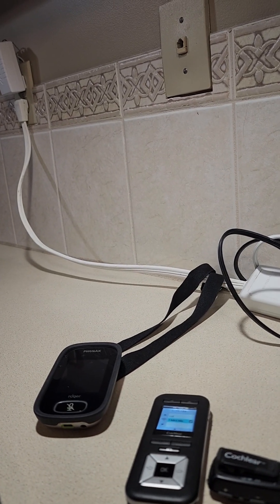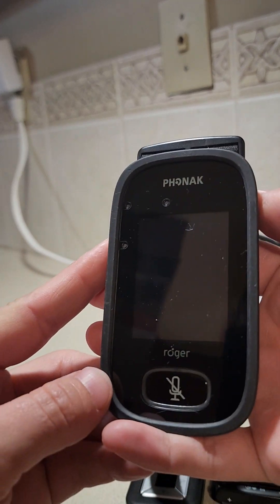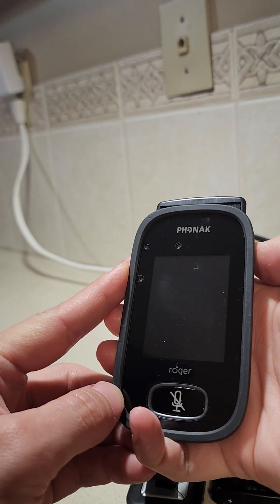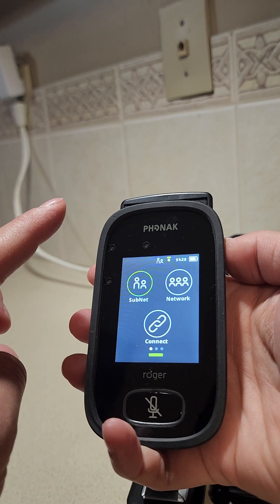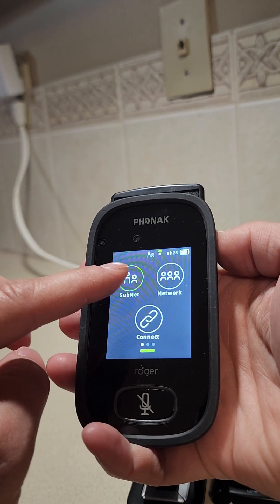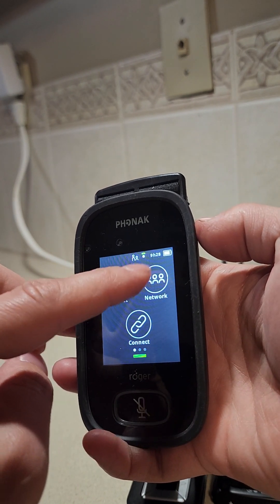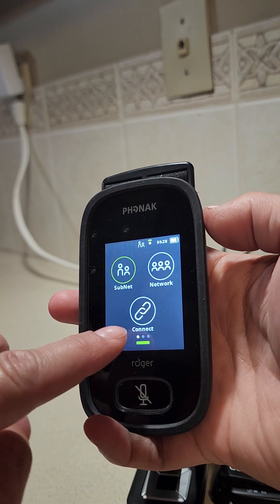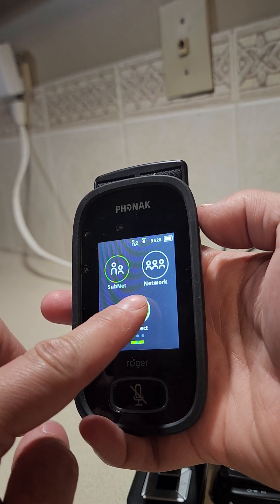Then we go to the Phonak touchscreen. I typically use the subnet option, which is just to connect one processor to the teacher. You can use network if there's more than one processor, but for my class there's only one. Press connect.